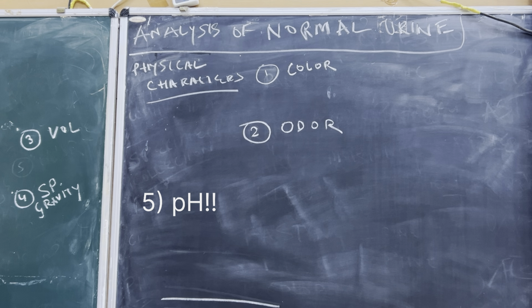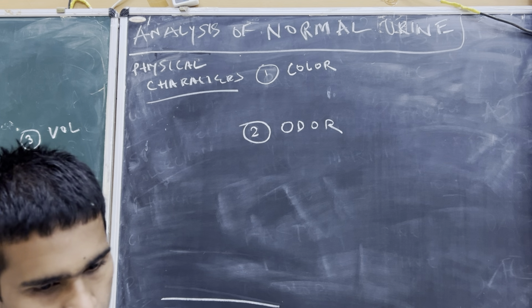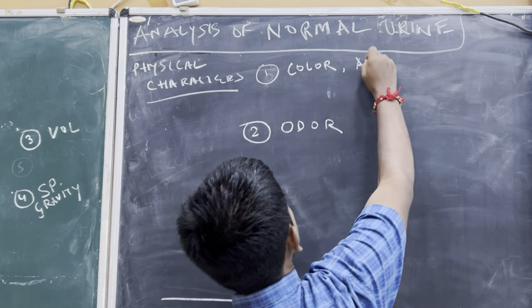We have color, odor, volume, specific gravity. And of course, with the color only, I will talk about the appearance.